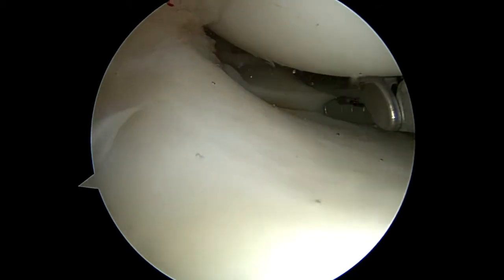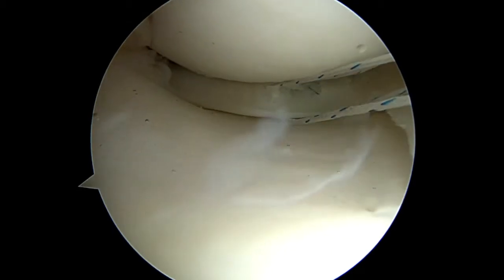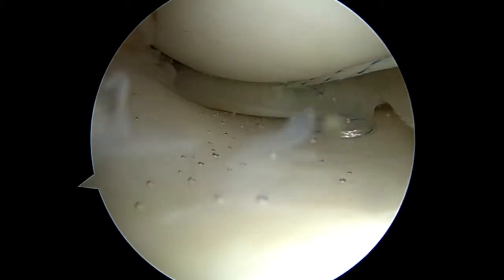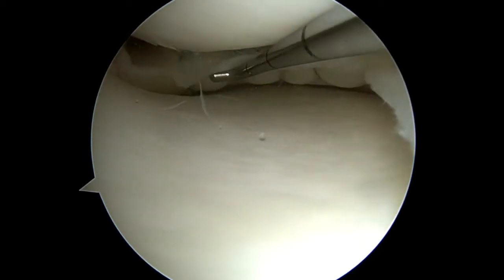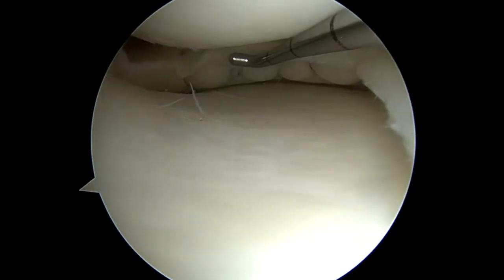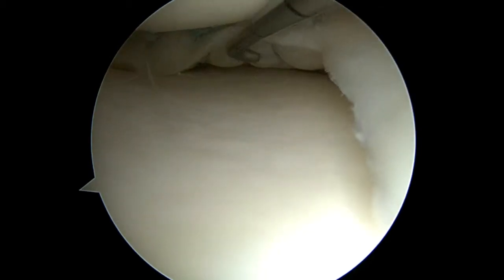Interestingly, in this meniscus, when I would turn the suction on, the whole meniscus would flop forward anteriorly like a bucket handle, but there was no discernible tear. And when suction was released and the flow went back in the knee, it would reduce. So you can see that this tissue is not normal — it's pretty floppy and soft back there, but nicely compressed with the circumferential compression stitches.